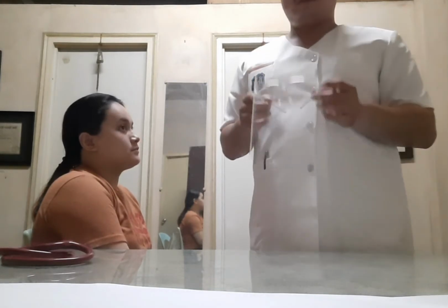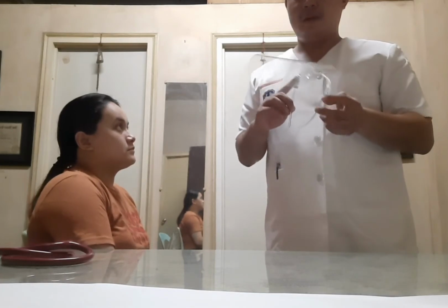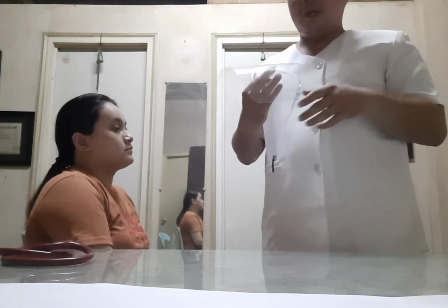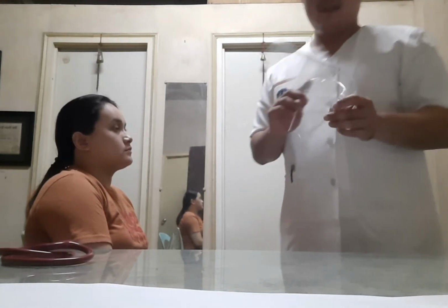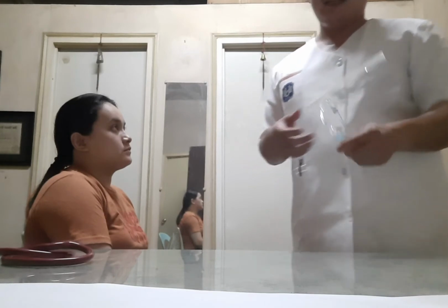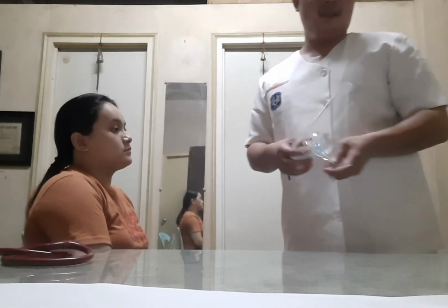You might be wondering why I didn't use the face shield. Obviously, in hospital protocol, you need to wear the face shield or any cover on your face so that the particles that come out of the mouth or nose of the patient, like for example the phlegm, won't reach you and you are protected. But for this video, I did not use it because you might not clearly hear what I'm saying and explaining while doing the return demonstration.